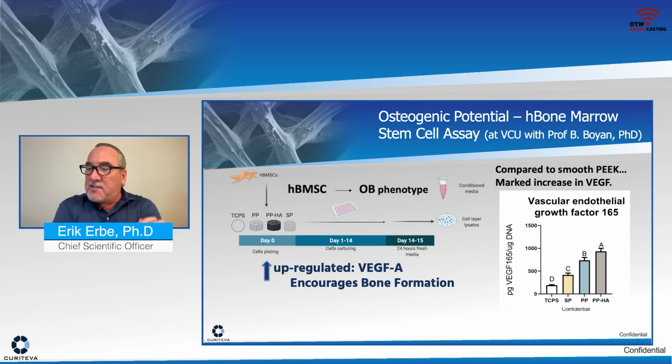Now, Barbara, this is because of our perceptions about PEEK, and in the past, most traditional PEEK elicits this inflammatory fibrous encapsulation. We didn't see that, and there's some reasons for that, but we wanted to generate a burden of proof. So I'll turn it over to you to describe the cellular work that you did for us.